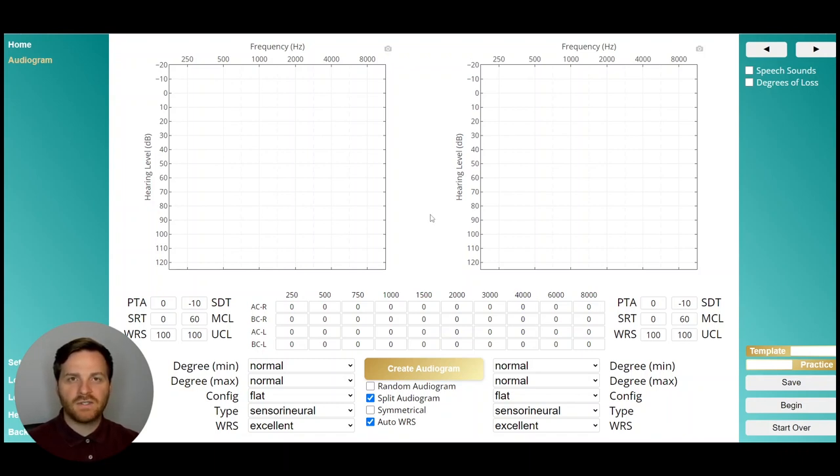But I'm going to go over some of the extra settings that are on this page and on the audiometer page. We know that you can use the degree min and degree max to choose the better and worse hearing thresholds for each ear, and you can change the configuration type and expected WRS score for each ear. Let's look at some of these buttons down here.